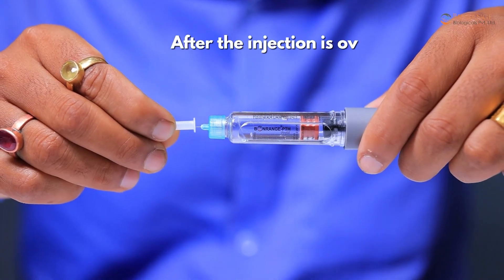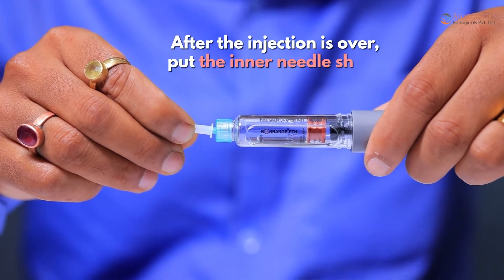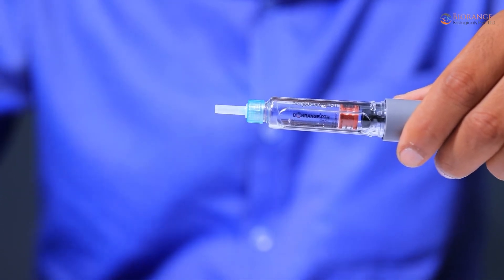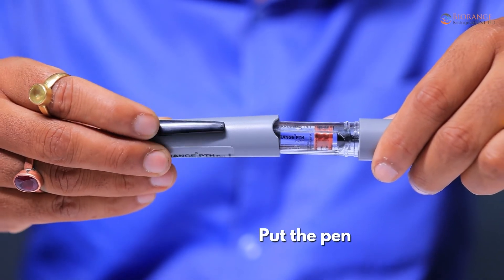After the injection is over, put the inner needle shield back on the needle, then put the pen cap back on.